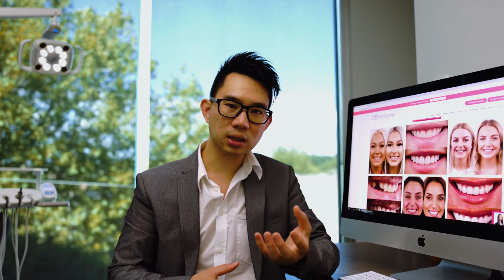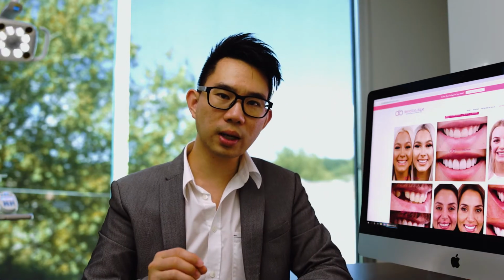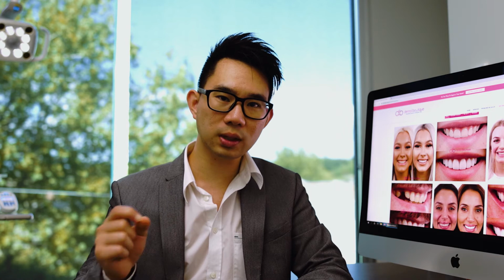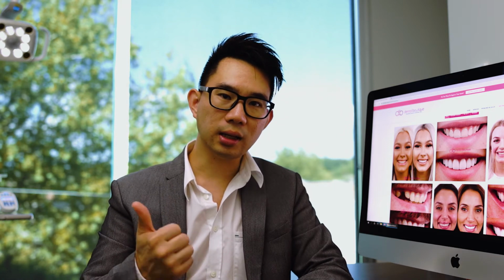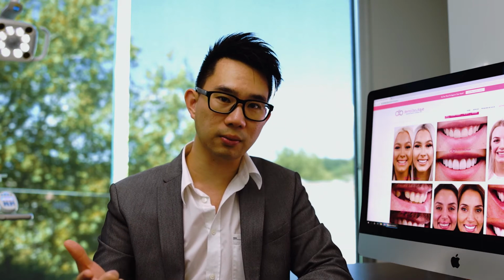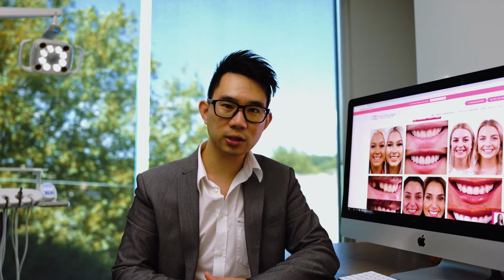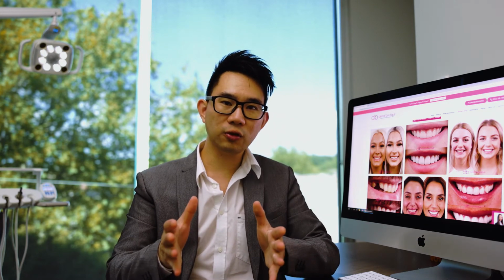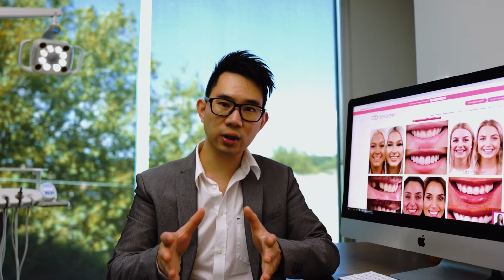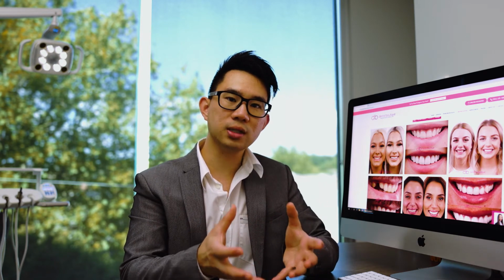Whether you do braces with metal or ceramics, the end result should be quite similar. With ceramic brackets, you've got a bit more maintenance that needs to be done, where they might break a bit easier. And number two, you need to brush them even better, because you don't want them to stain over time. Metal brackets will not change in color at all. So they'll stay metal and they'll look the same from start to finish. So hopefully that has given you a bit of understanding of what metal and ceramic brackets are, and braces as a whole, as a treatment type.